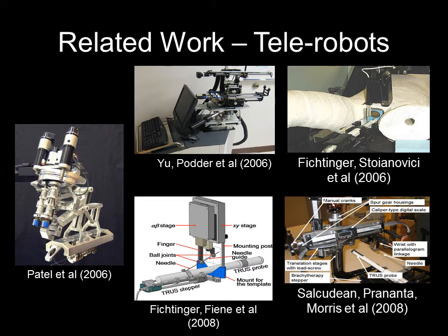There have been a number of attempts to introduce automation in brachytherapy earlier. These robots have focused on positional accuracy using parallel needles. There have been robots which can insert needles at a continuum of locations and angles, but most of them focus on low dose rate brachytherapy. Here, only one needle is inserted at a time, and we need to implant a complete set of needles before inserting radioactive source in high dose rate brachytherapy. We have introduced an end-to-end automated system compared to the existing paradigm of teleoperation.